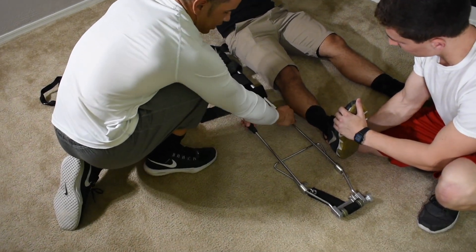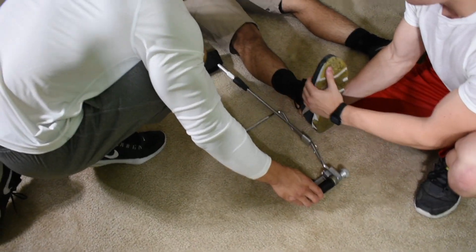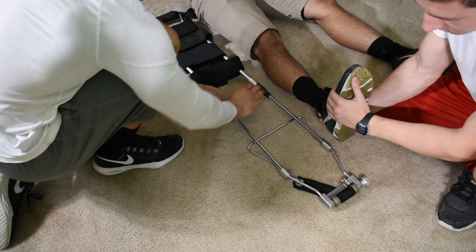It's just a hair long, so what I want to do is go lefty-loosey with these two black parts and then bring it to size — a little bit better. I like that.